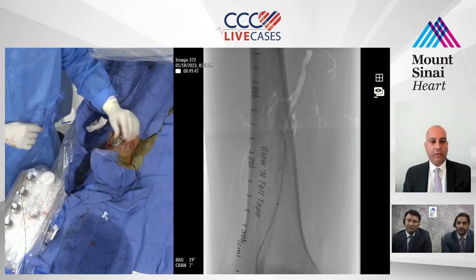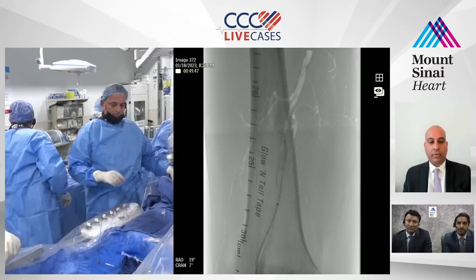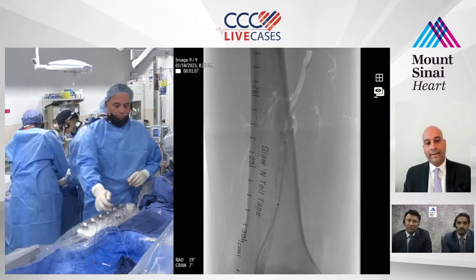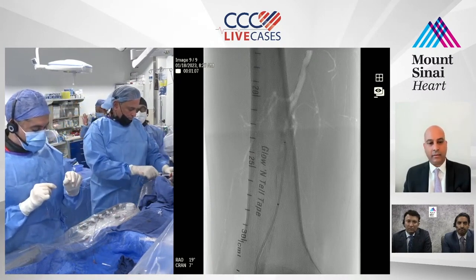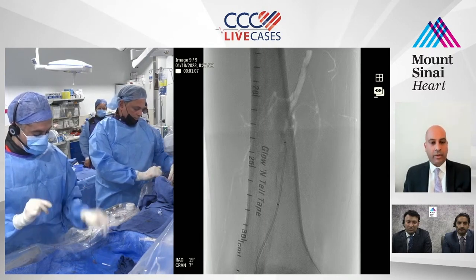I think the other thing that we've done with a lot of these patients is we've staged them as well. I've punctured patients like this with their distal disease first, and then come back a different day to tackle that CFA disease, when they're not ideal surgical candidates, right? Because then you have options where you can puncture different things.